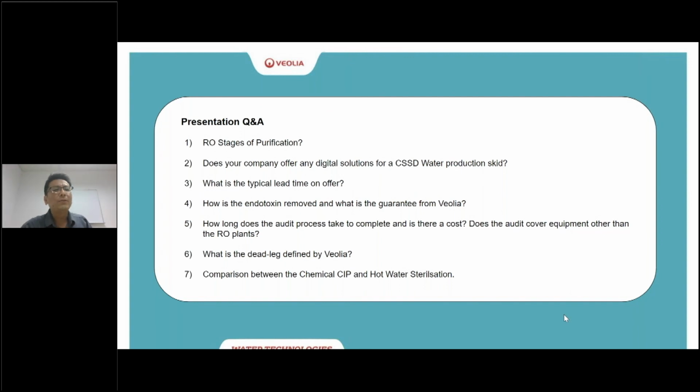An example of a not so easy approach could be hypochlorite, which is a chemical that we use more as an oxidization agent. Also hydrogen peroxide, Minncare, Ultra Clean, caustic, or chlorine dioxide.